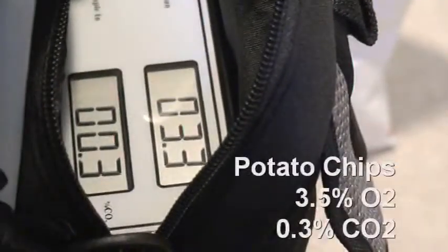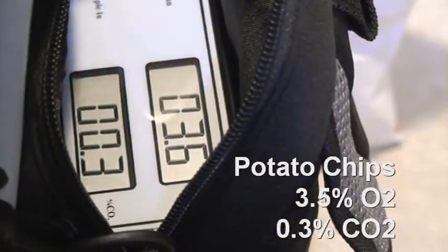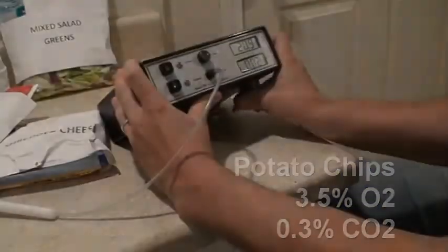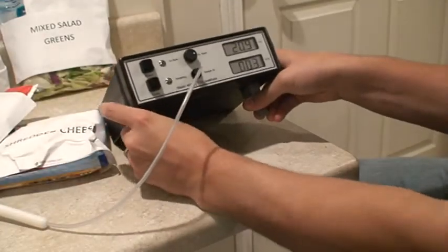Now for a bag of potato chips, this result came out about as expected: 3.5% O2 and negligible CO2. Now we've removed the analyzer from the nylon bag.